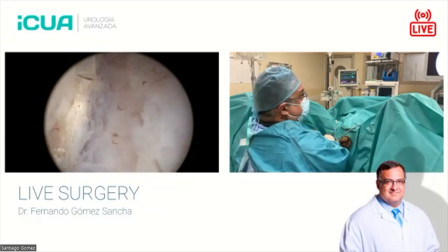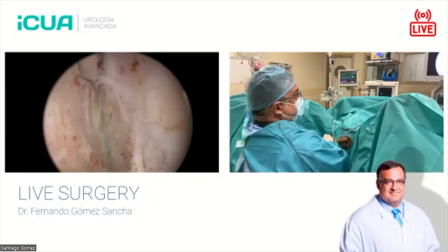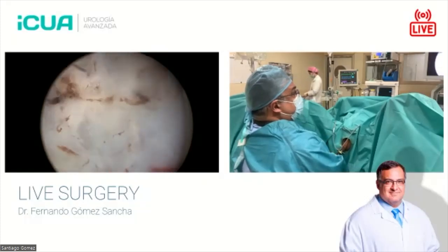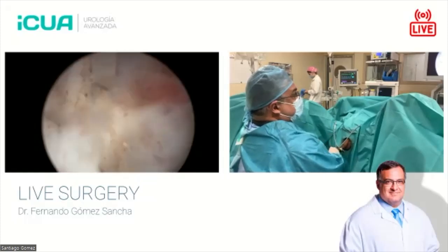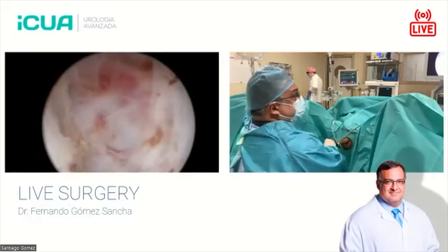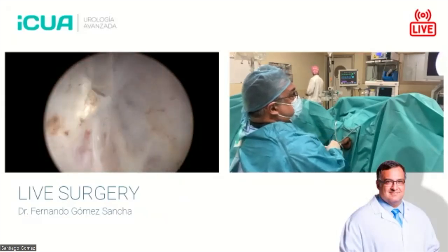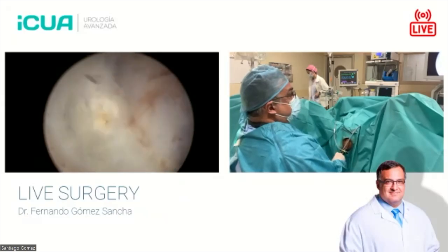So here I'm trying to develop the lateral plane. But again, I come out to check. You see here, I could go further up with my liberation. So I go a little bit further up, following my line and following my plane. If I see that, you see here, for example, it looks a little bit deep. So I don't want to fire there. I have to aim my laser closer to the adenoma to correct the plane, you see?